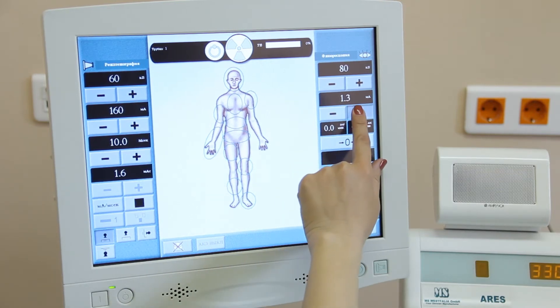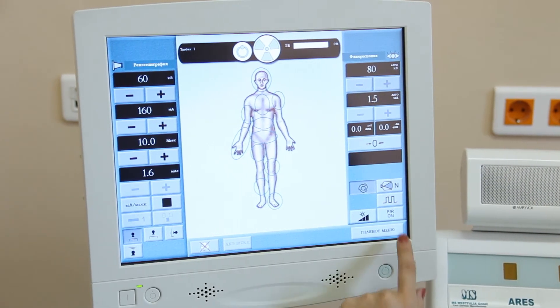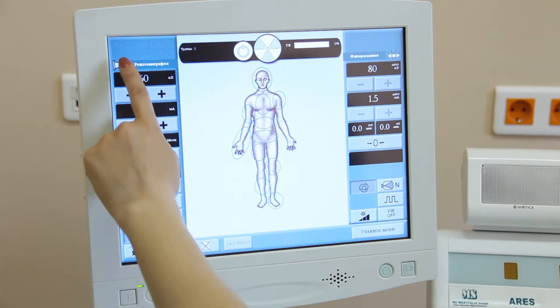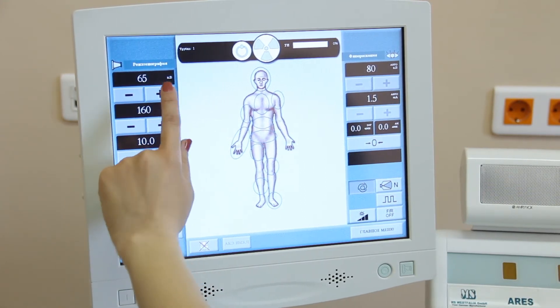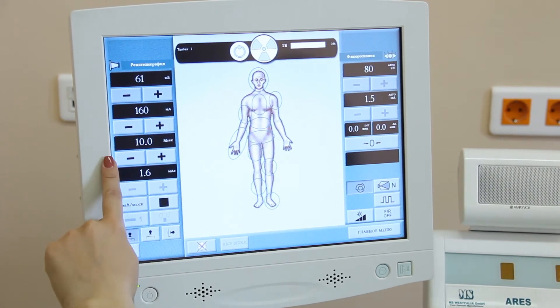The control buttons at the bottom allow setting a required mode for radioscopy. Parameters of radiography may also be adjusted manually. The control buttons at the bottom allow setting various modes for radiography.